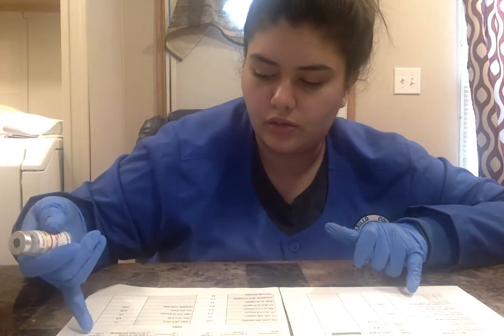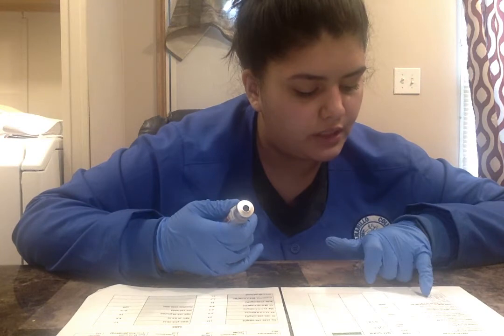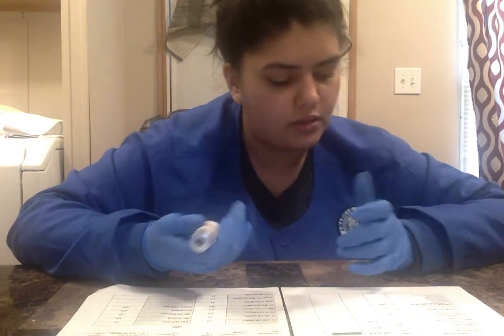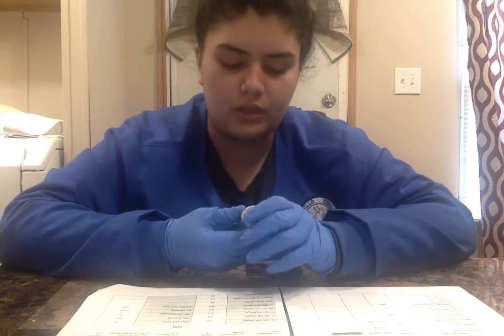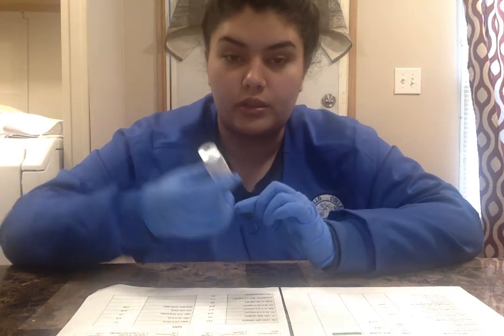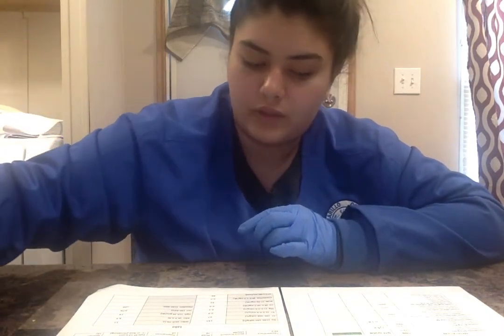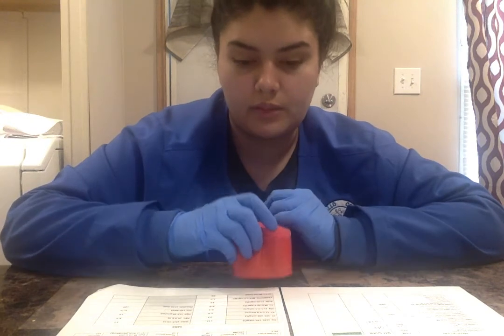We're going to look at her blood glucose. It was 191. We're going to look at the sliding scale. It says to give 2 units if the patient is between 150 and 199. So that's good. We're going to go ahead and administer this medication. The expiration date of this medication is 8/12 of 2020. We have the right medication. So now we're going to go over to the bedside, and we're going to tell Miss Kitlano.